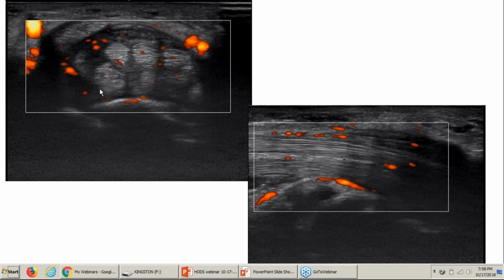consistent color Doppler. So on this wrist, if I turn on the color Doppler, you will see the areas that are lighting up come like a pulse, on and off, but the same areas will show color Doppler. When you see color flow, make sure you can repeat the same pattern at least one more time. That's how you know this is true vascularity and not motion artifact. And try to get that in long axis.